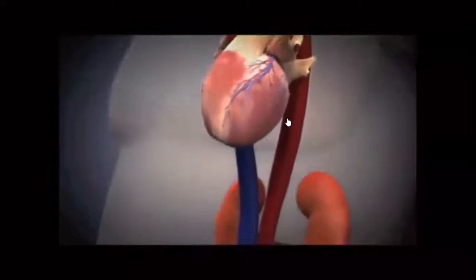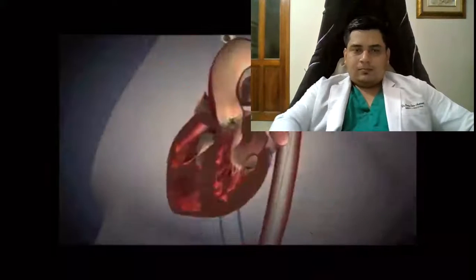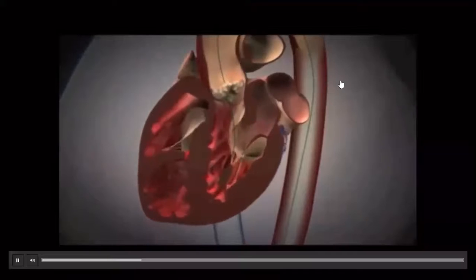So to perform the TAVR, or transcatheter procedure, a wire is inserted in the femoral artery. It is threaded up through the aorta and around the aortic arch. And then that wire is passed through the stenotic aortic valve and placed in the left ventricle.